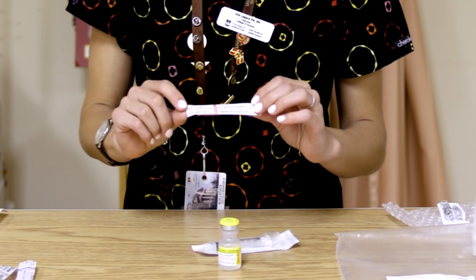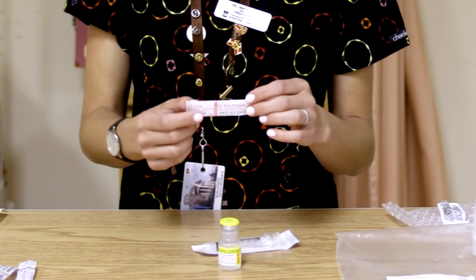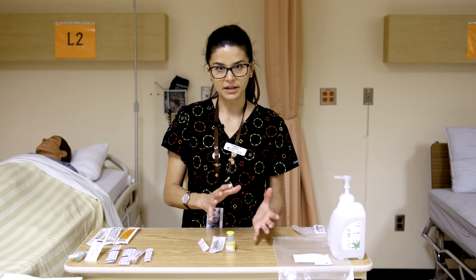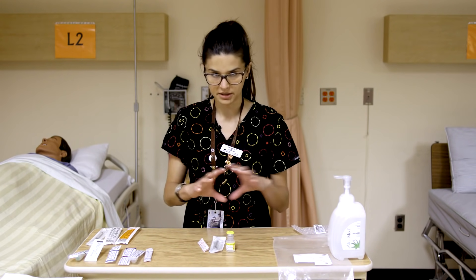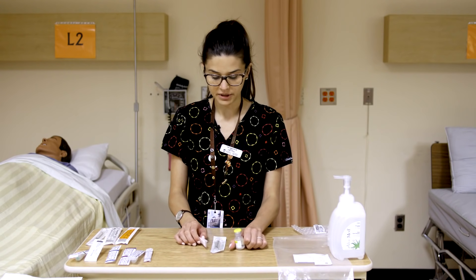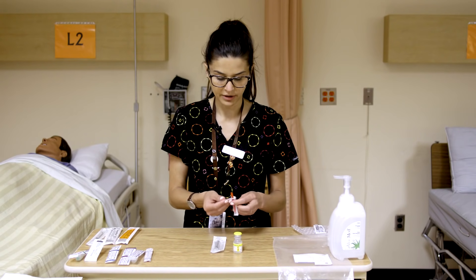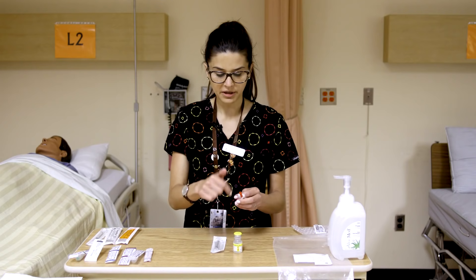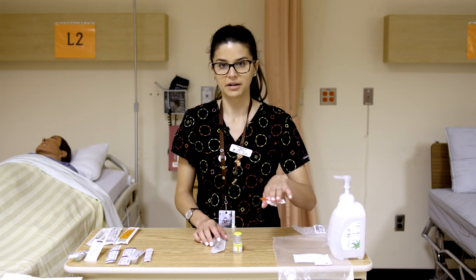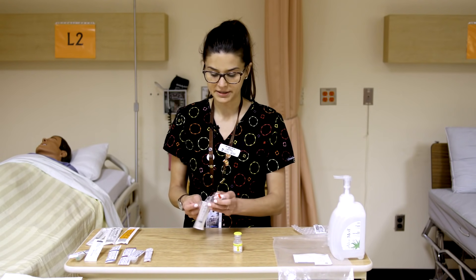The blunt fill needle is a rather large gauge — it's an 18 gauge and a one-and-a-half inch length, so it's quite long. We'll talk about what gauge and length mean in a moment. When we open our blunt fill needle, we need to be careful not to touch the end or the hub of the needle, because we want that to remain sterile.